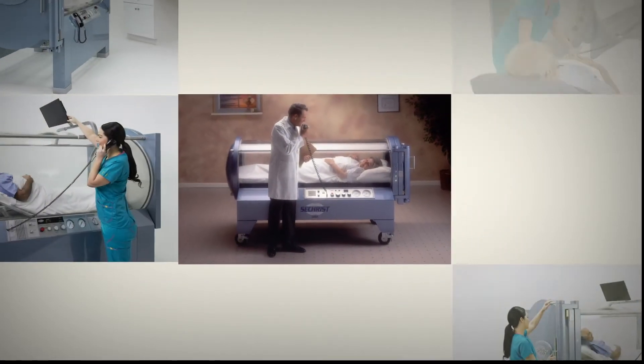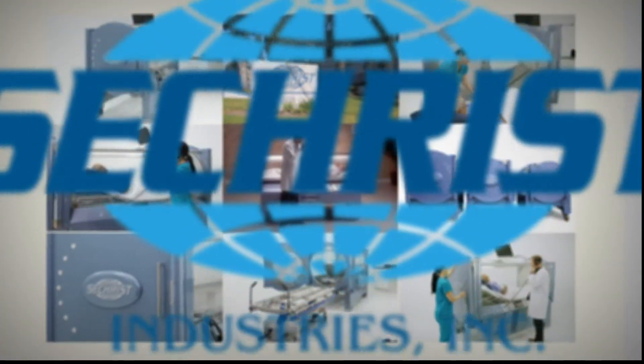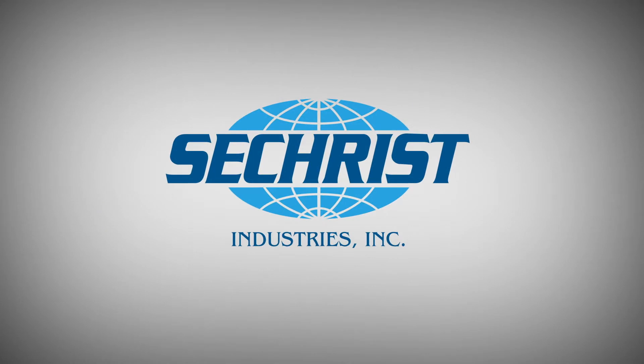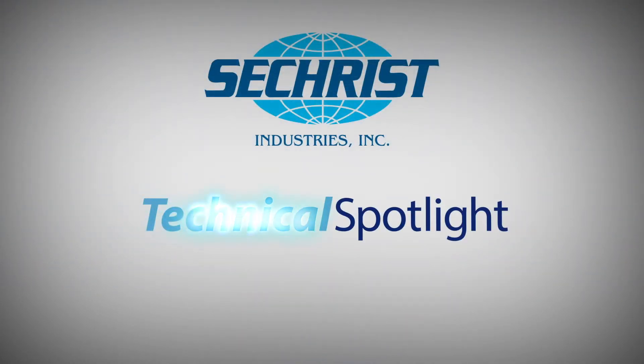Welcome to Sechrist Technical Spotlight, where we show you how to easily perform maintenance tasks on your Sechrist Industries hyperbaric chamber. As always, if you are unsure of how to perform any of these tasks, please consult with one of our professionally trained field service technicians.